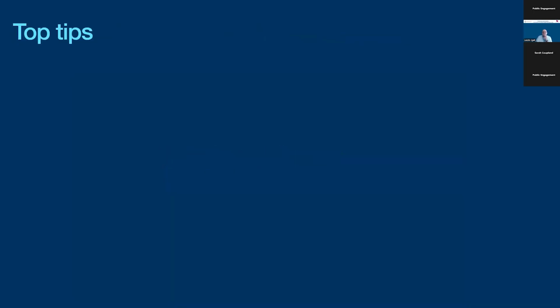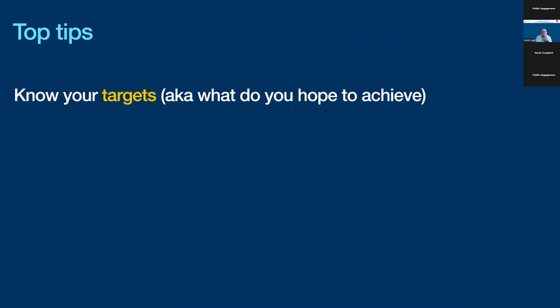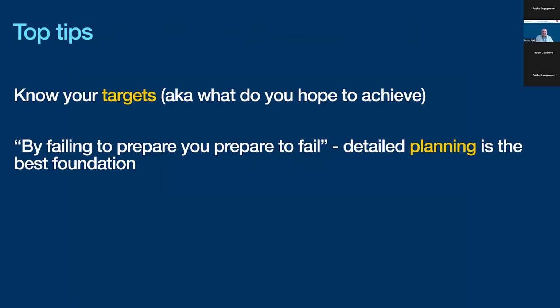What are the things I would like to recommend for you? You need to know your targets, what you would like to achieve, because many people may not want to do full digital integration. We have some pathologists who are close to retirement and they don't want to be engaging with digital. All that said, our most fervent digital pathologists are the older generation who realize how much time they can save with digital.